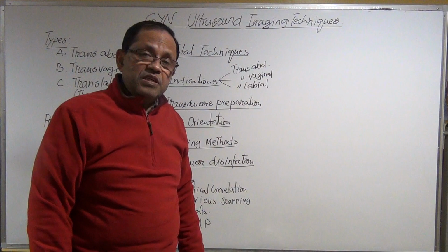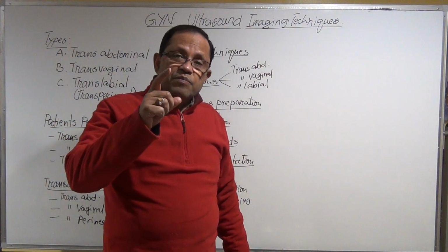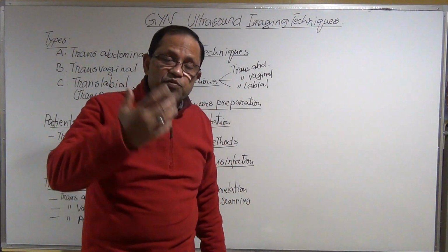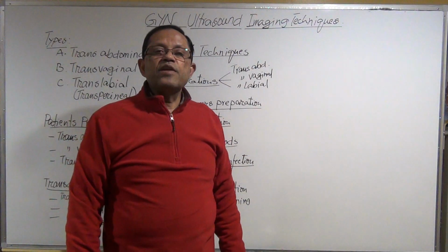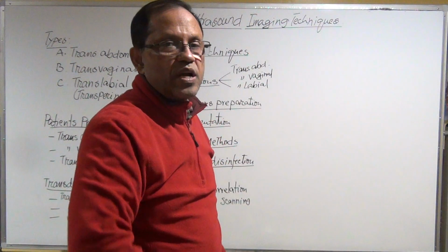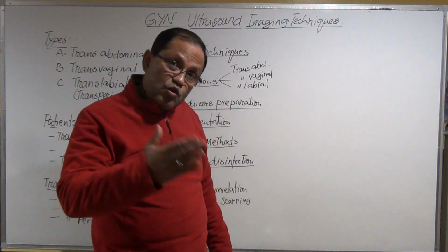The patient may need to be sedated, but I need to check the uterus, I need the full bladder. We cannot ask the patient to drink water because this patient may need to go to the OR.